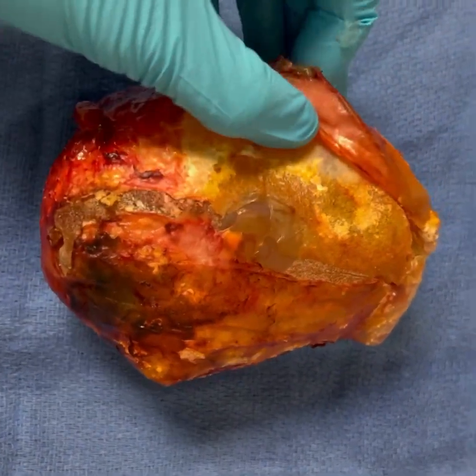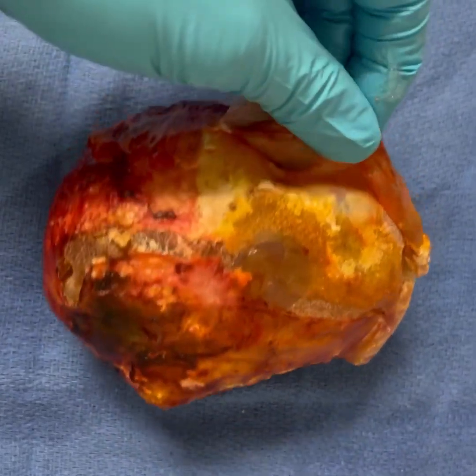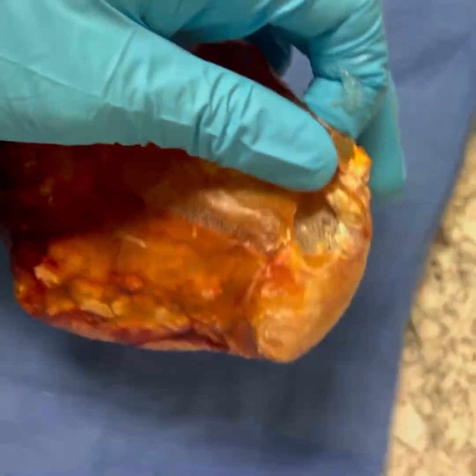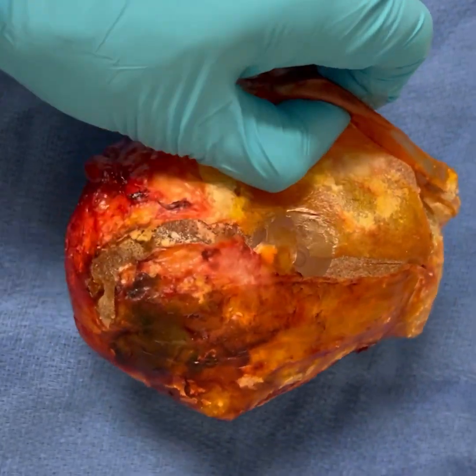All right, everyone. So this is a breast implant that had been in a patient for over 20 years and had developed massive capsular contracture. She had capsular contracture within the first year and just never really had it taken care of until we recently just removed it.